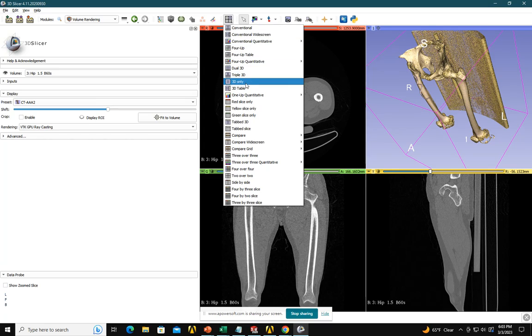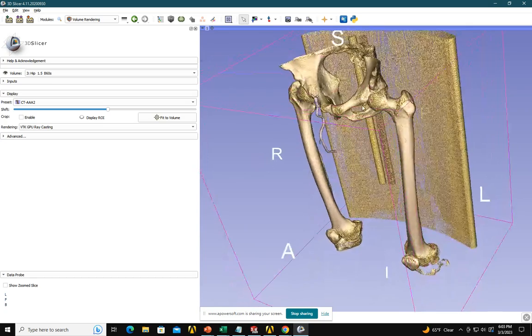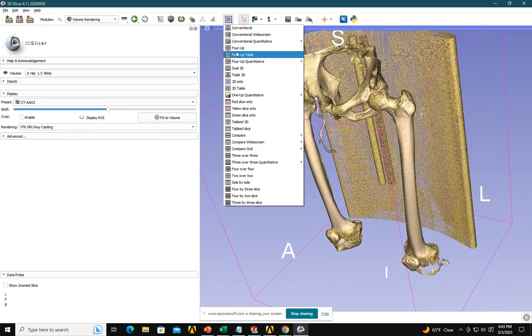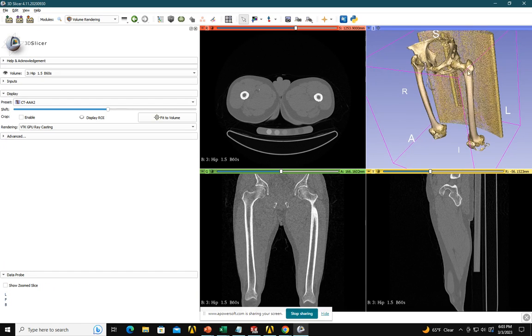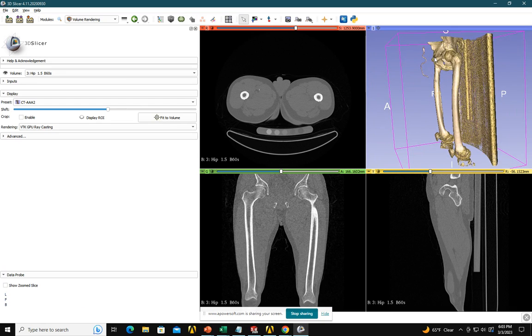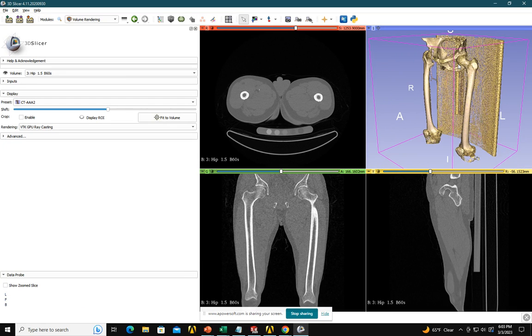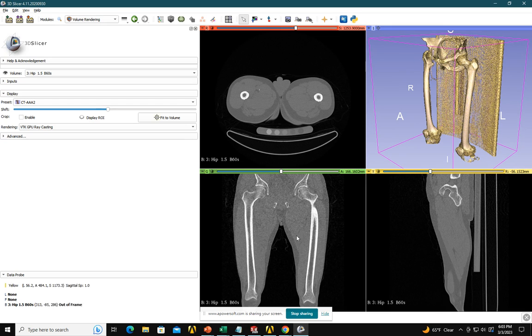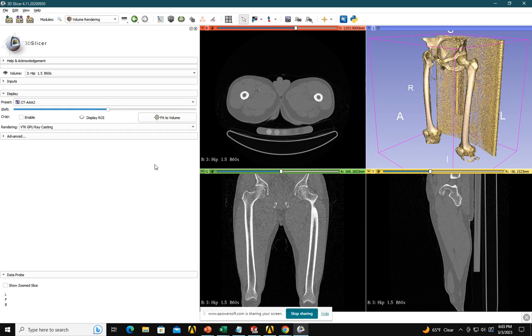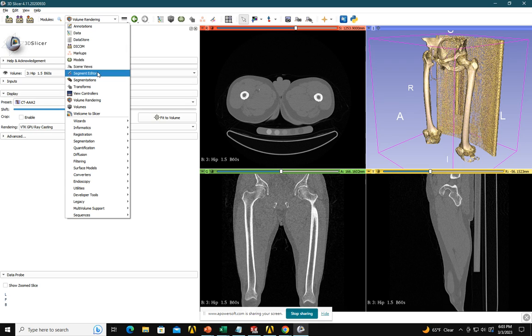Here you can see only the 3D view. So it will give you 3D only. Let's say you want to go back to the default view — you will go here. Right now this is just the 3D view; I haven't formed the image yet. The STL file is not formed. Now let's say I just want to get this femur bone. I don't want the pelvis bone or the muscles — I just want the 3D femur bone. So I will go here on the Segment Editor.